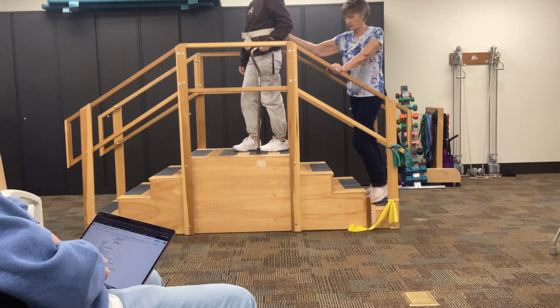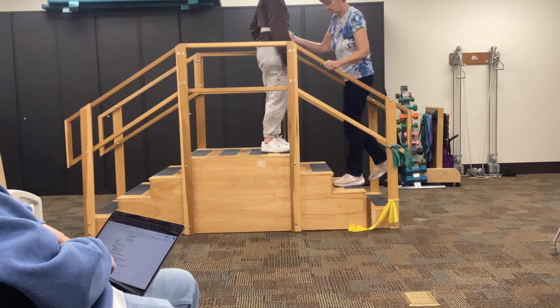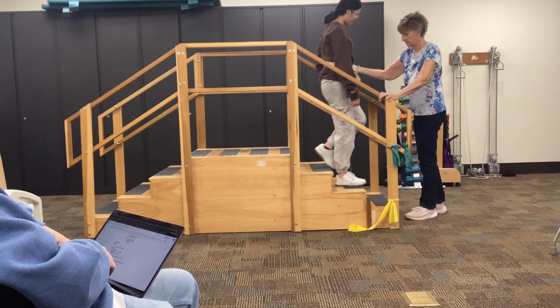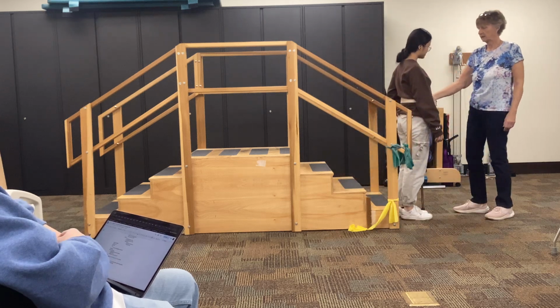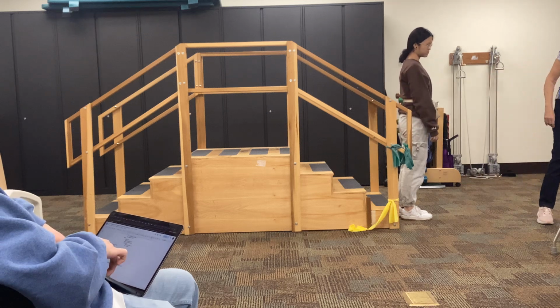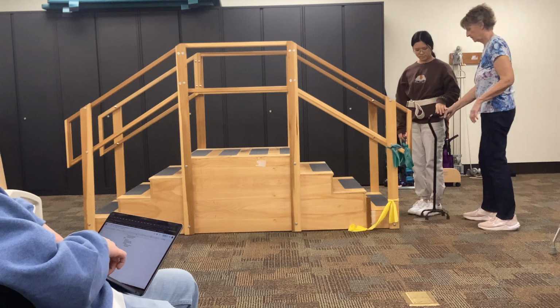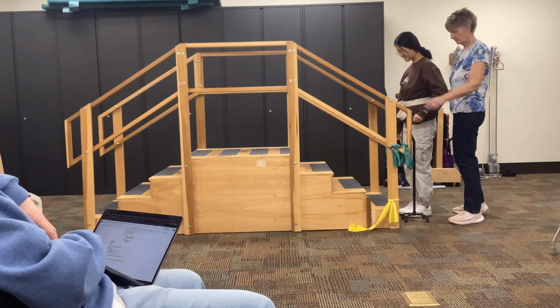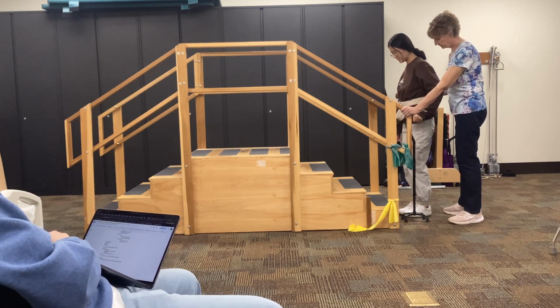Okay, I'm gonna turn around. Okay, how you gonna come down? Okay. Piece of cake, right? All right. Wrong height, but we'll just take a look at. All right. Let's see what you can do here. So, I assume same thing.